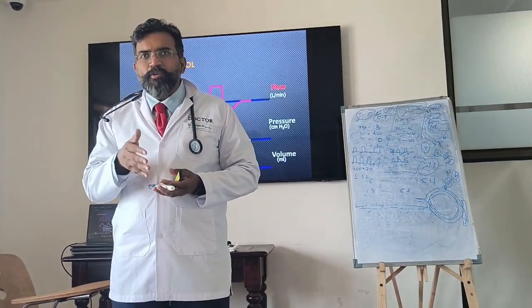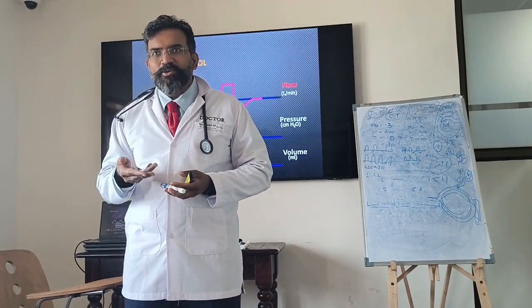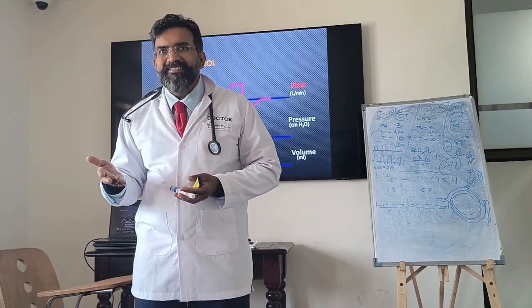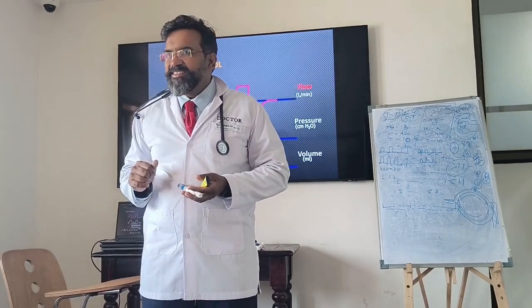अगर तुम पेशेंट को कम वॉल्यूम दोगे तो सपोर्ट कम हो गया ना उसका. पेशेंट को ज्यादा चाहिए इसलिए तो ज्यादा लेने की कोशिश कर रहा है वो. तुम उसको कम कर दोगे तो प्रॉब्लम ज्यादा हो जाएगा. उसको ज्यादा चाहिए, प्रॉब्लम ये हो गया है. ज्यादा क्यों चाहिए? क्योंकि उसको फीवर हो गया है.